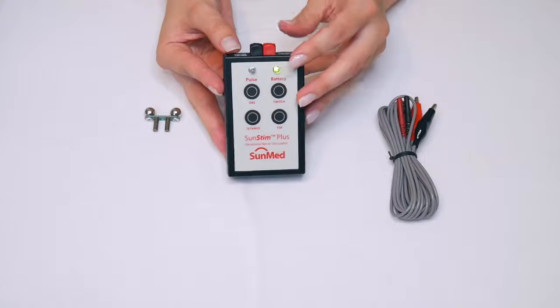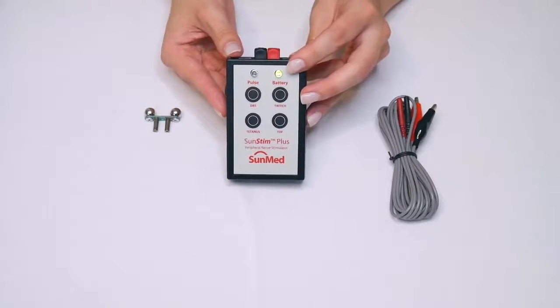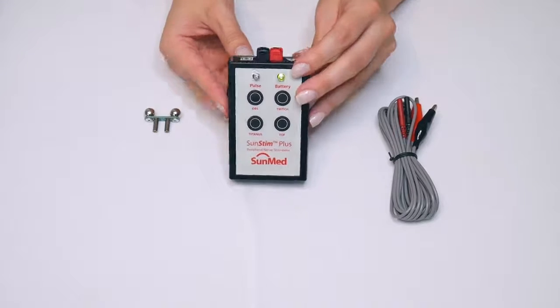When the Nerve Stimulator is turned on, the battery light is green. When it turns yellow, that is your indicator that the battery must be changed.